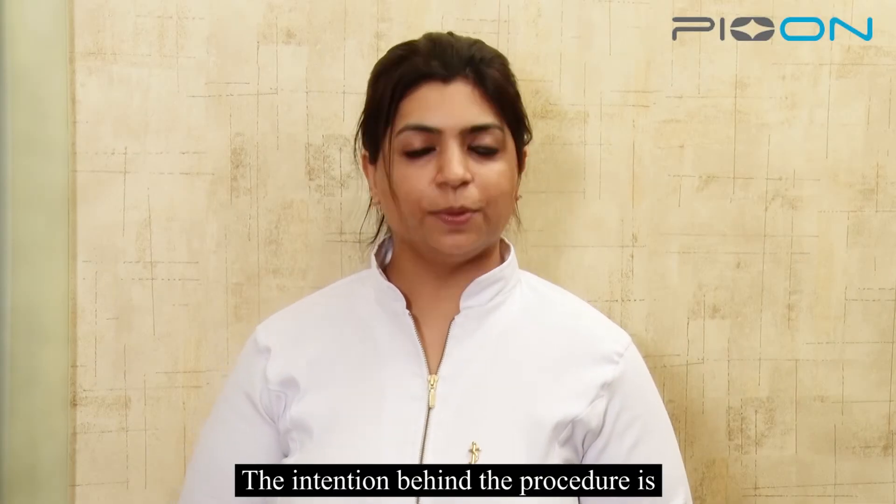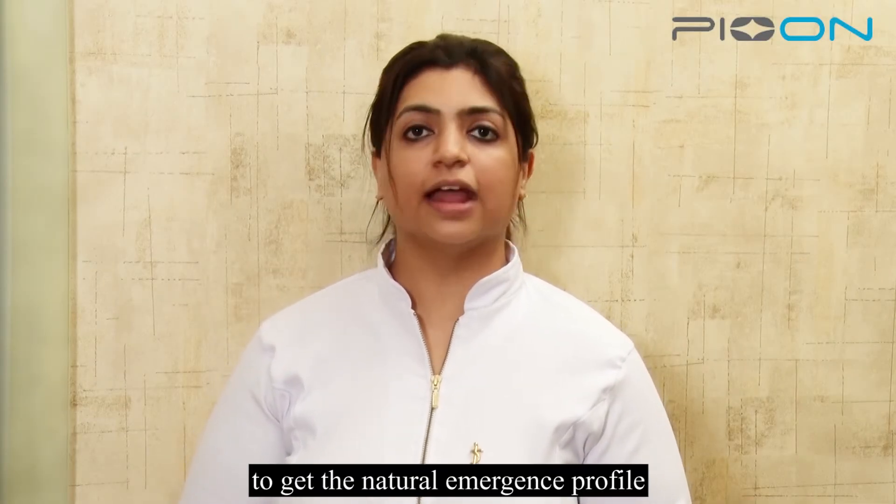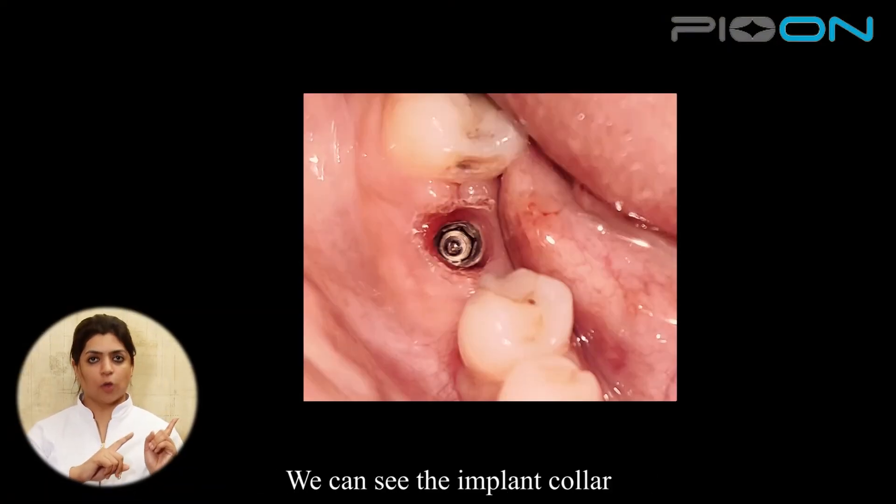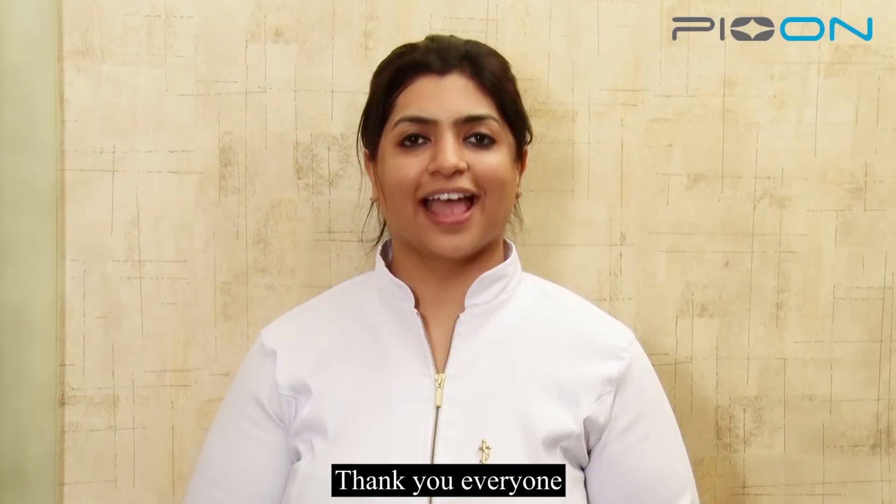The intention behind the procedure is to get the natural emergence profile. After removing the healing abutment, we can see the implant collar. Thank you everyone.